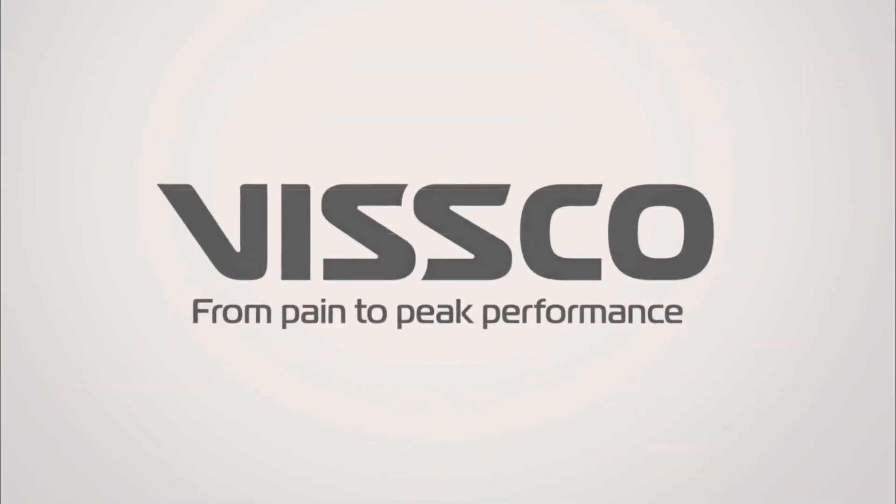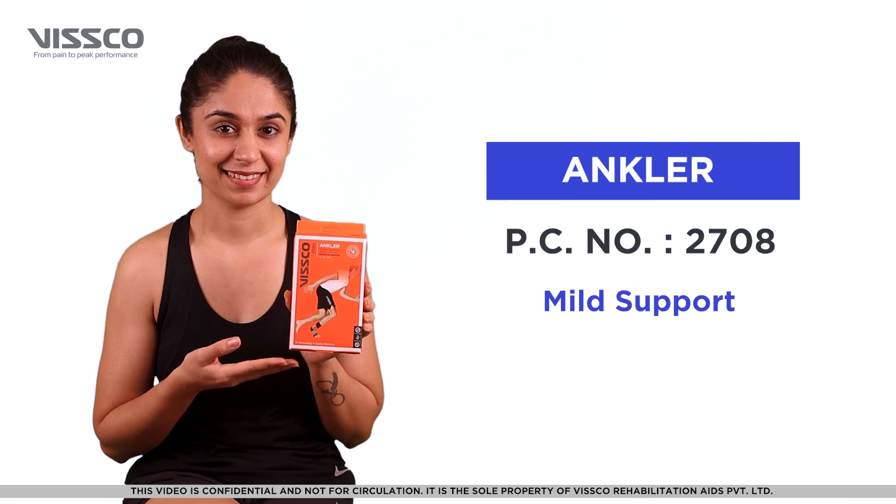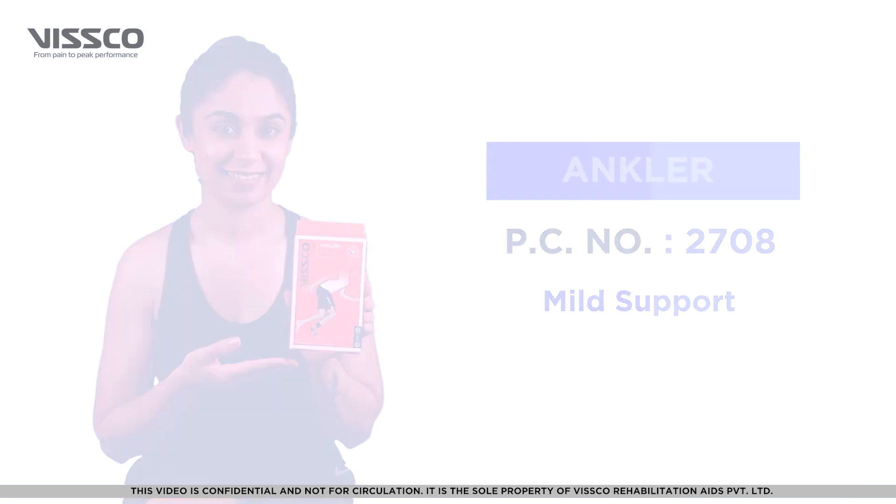Hi there, greetings from Wisco. Let us now see how to wear the Wisco Ankler. Product Code 2708. The Wisco Ankler provides support and stability to the ankle.